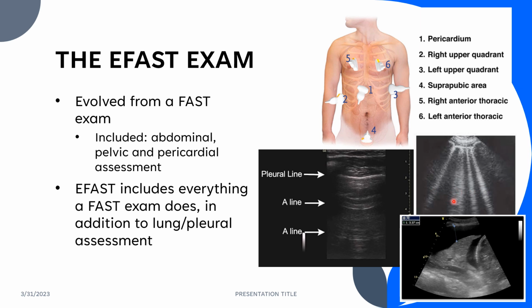And in order to diagnose B lines, you need to find these in multiple, meaning greater than 2, different rib spaces. Okay. The other thing you're looking for, and this is probably the very most prominent, you set the transducer down, you see a collapsed lung here, and you see a lot of fluid, which is our anechoic area here.